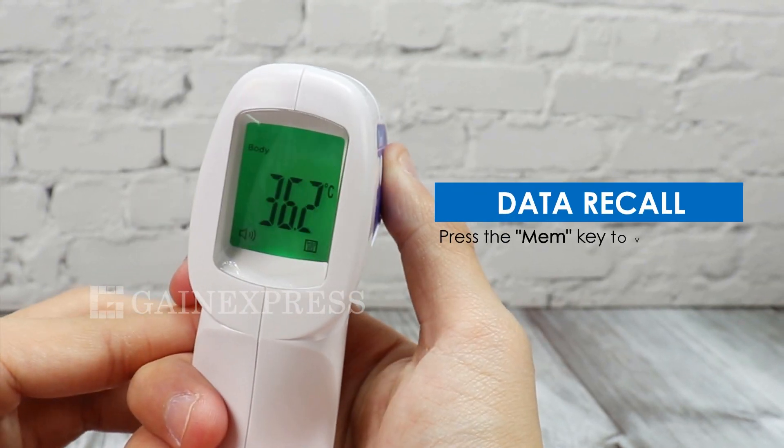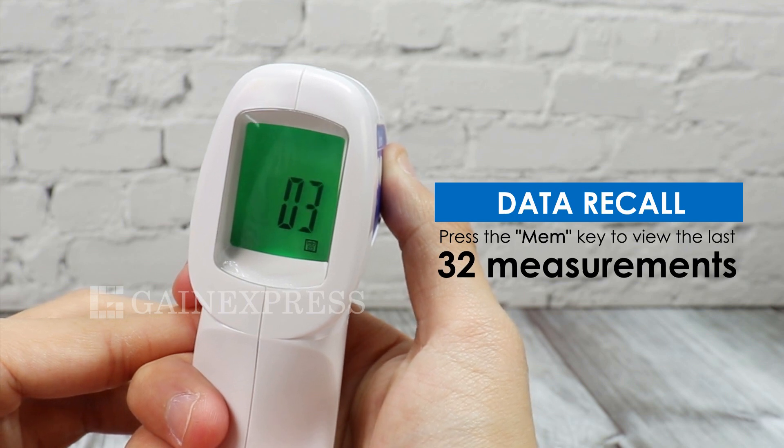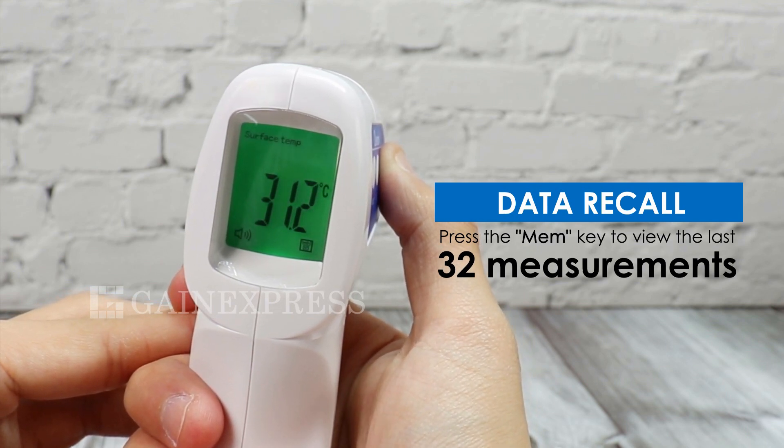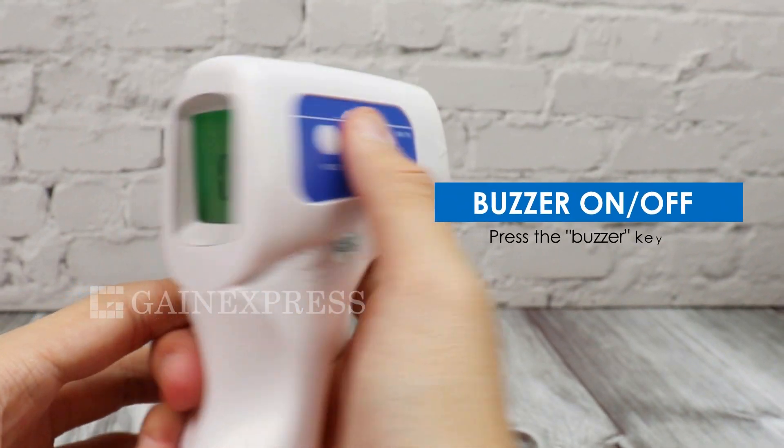To view the stored data, press the MEM key. It can store up to 32 measurements. Press the buzzer key to turn on and off the sound.